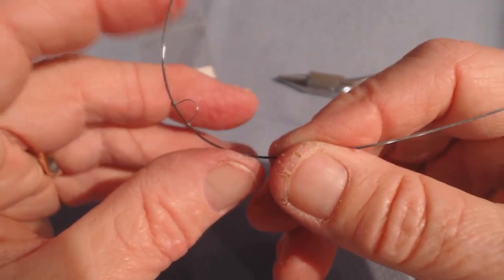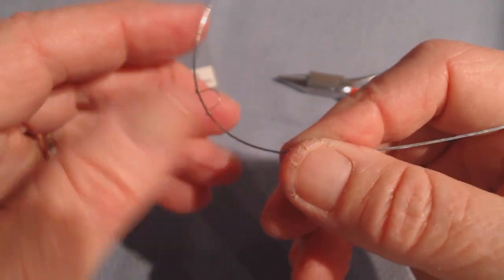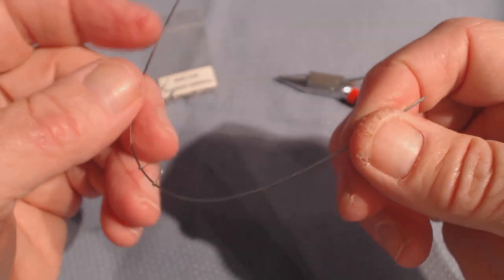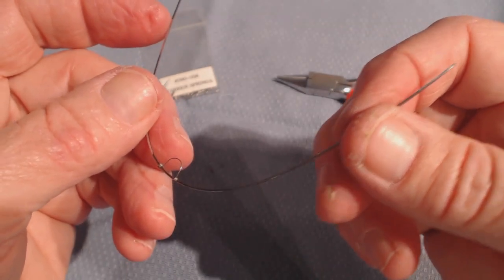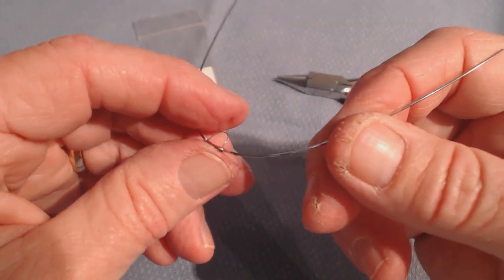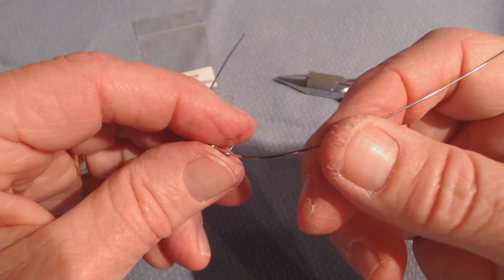And if you're smart, you will also lace very tightly, three to three, or six to six, to keep the crown in the same place. And remember, doctors, you want the root to move back and not the crown to move forward.